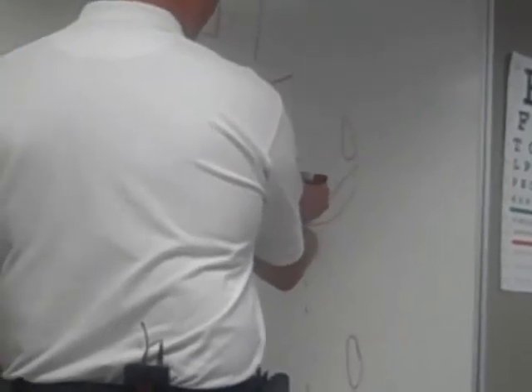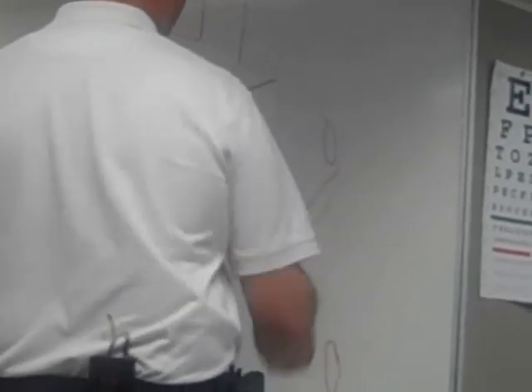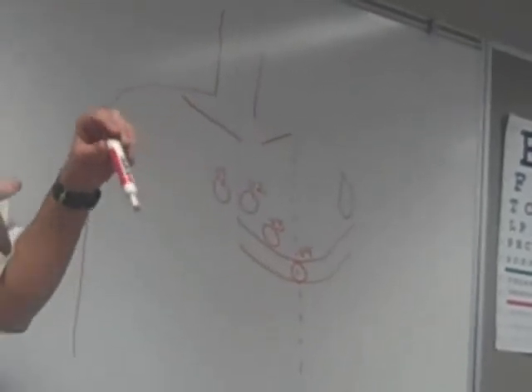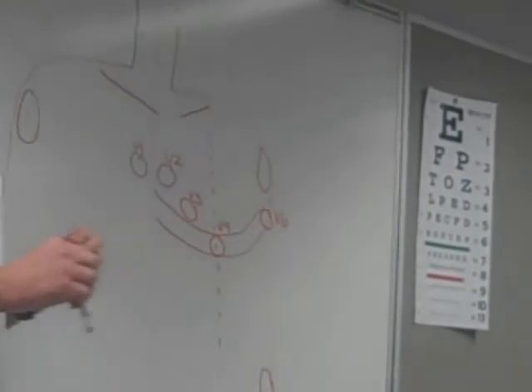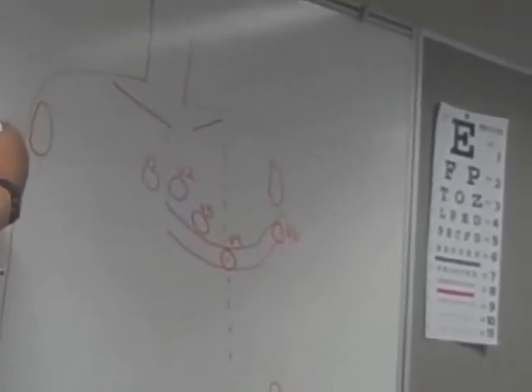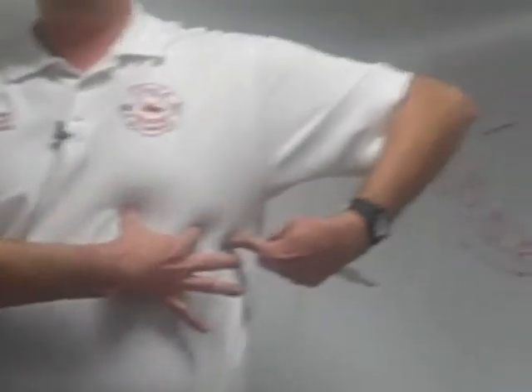It actually ends up about in your 5th intercostal space. If you follow the curvature of that rib all the way around, you're going to put V6 mid-axillary. And then V5 gets spaced evenly between your mid-clavicular and mid-axillary. So we'd have one here and one here. V5 will go right in there.